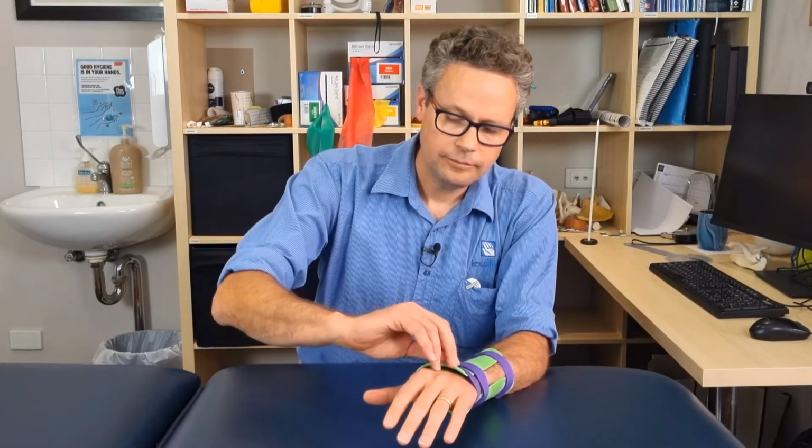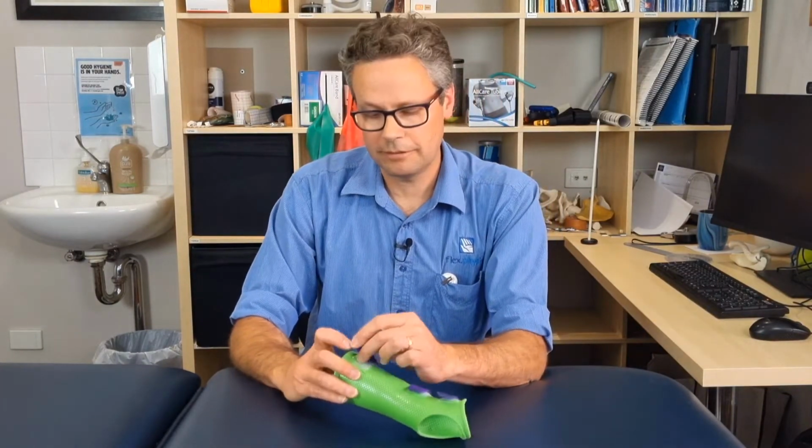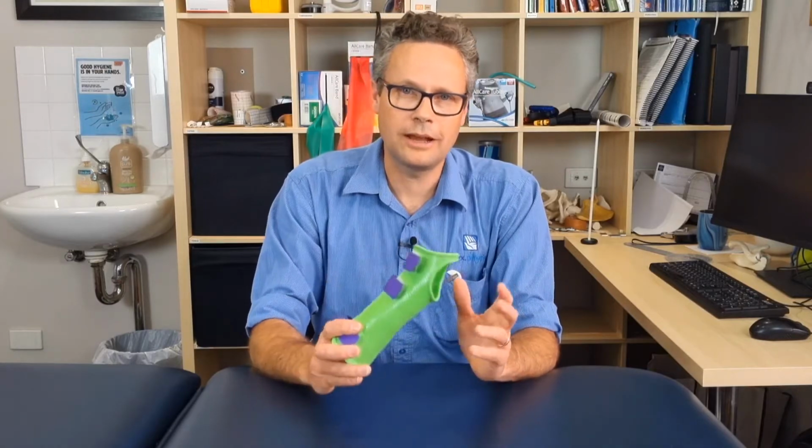And thirdly, when a splint is wet and not dried properly, or if it's getting sweaty inside, the skin might start to get soft and white. It's called maceration. And that just means you need to spend a little bit more time with the splint off to let the air get to the skin and let it dry out again. If you're having any trouble with your splint, make sure you go back to the hand therapist and ask them to check it for you.